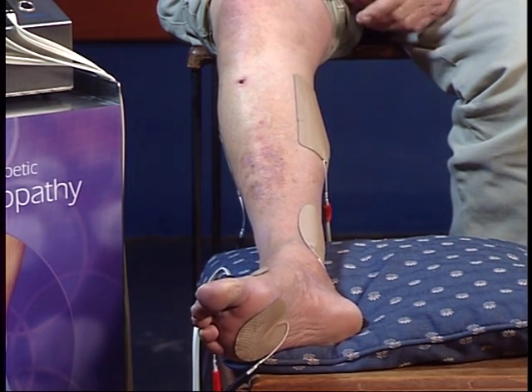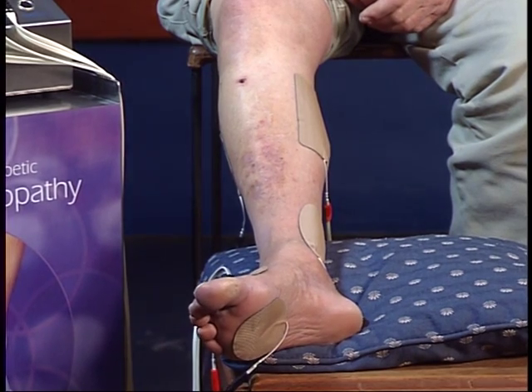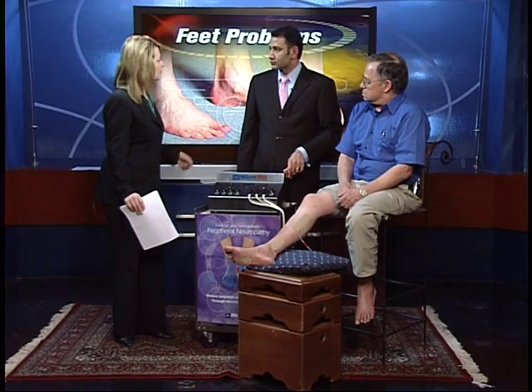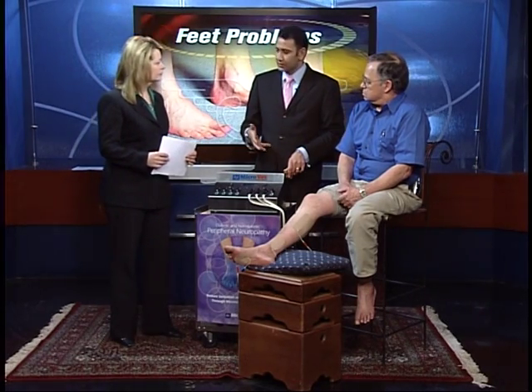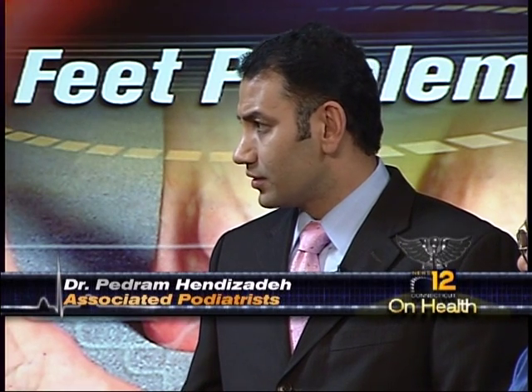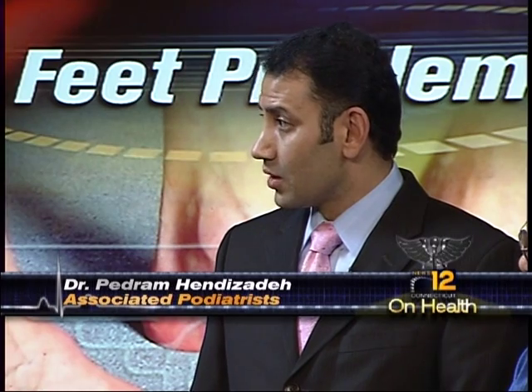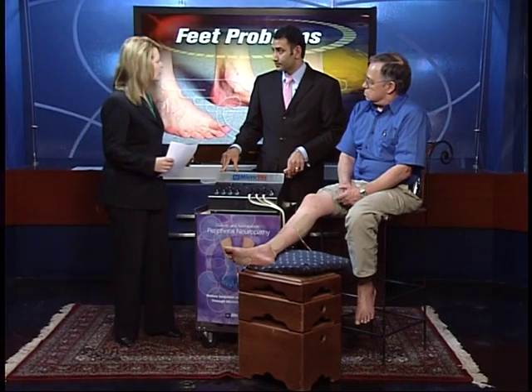It doesn't hurt? No. Doctor, is this like actually the same as if he was out at a gym working out with these muscles? It's similar to that. This is meant more for patients that are not ambulatory — they can't walk that far. Patients with walkers or crutches who can't walk more than 100 to 200 yards without having pain. So this helps improve circulation without having to get up and walk. And that is the key — getting that blood moving.